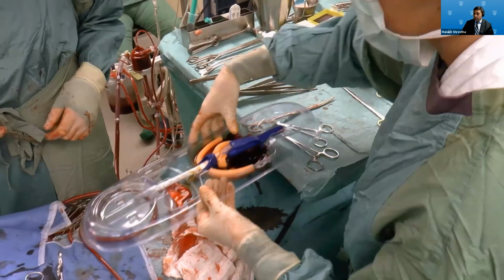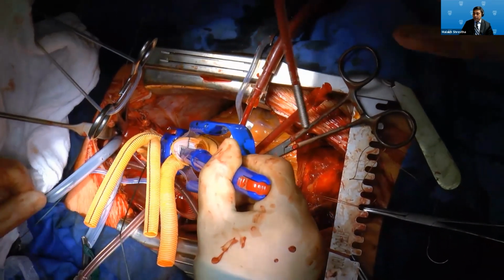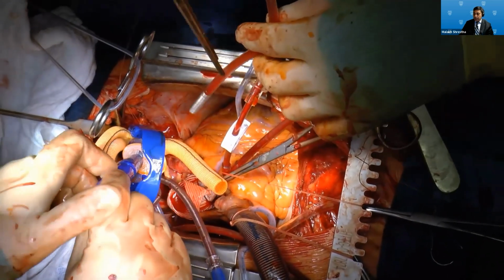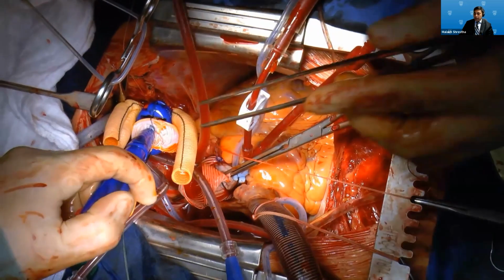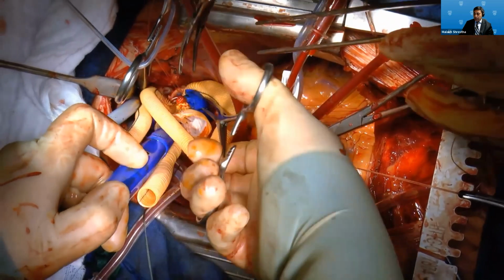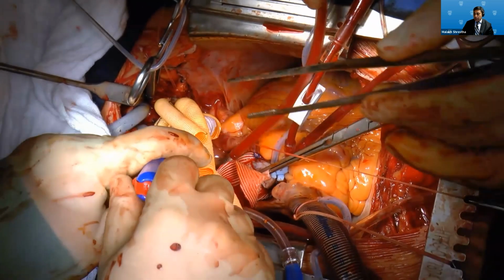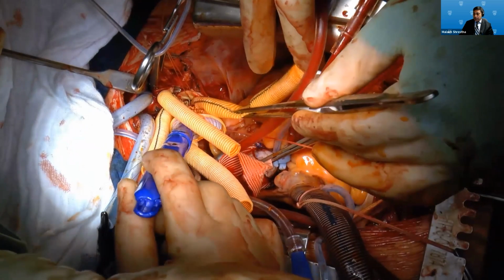We do wash the Thoraflex graft in rifampicin. So you can see that this is still the first generation device. The only difference between first and second is that in the first one, the clip is taken out. In the second one, you can cut it out. So it is very quick. This is the first generation where you just take out the clip. This is what we used in Europe for many years, until we designed the new device. Otherwise, it's more or less the same 3-step deployment.